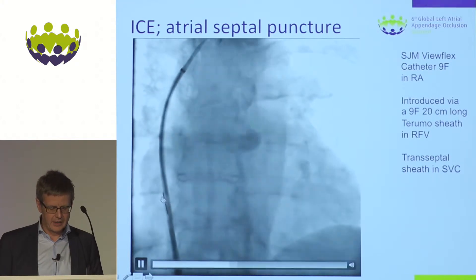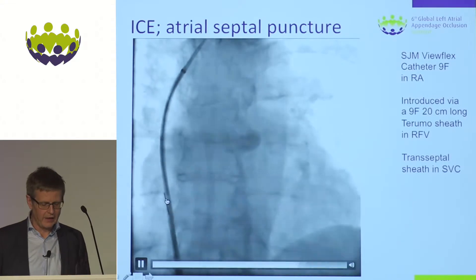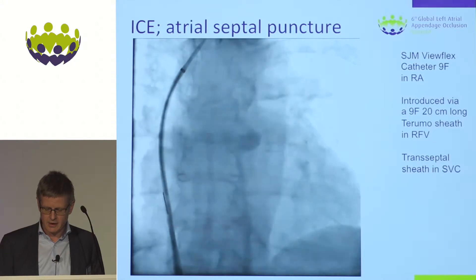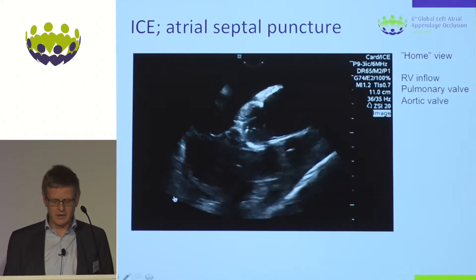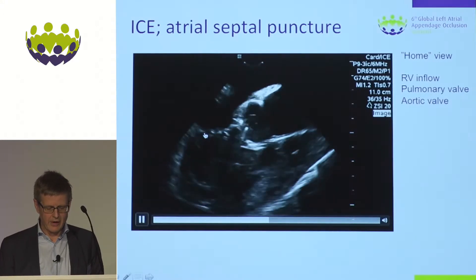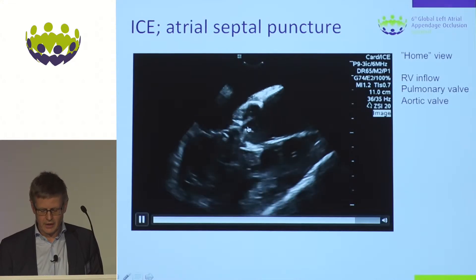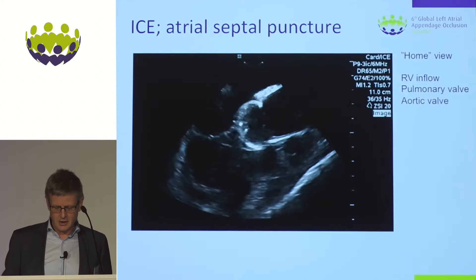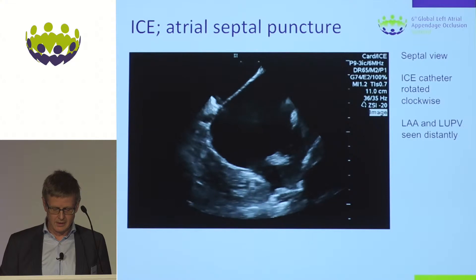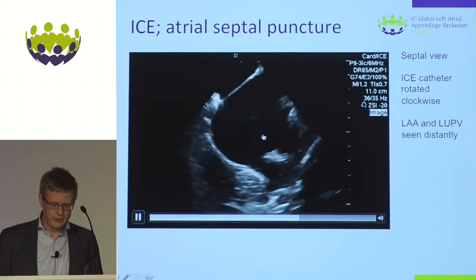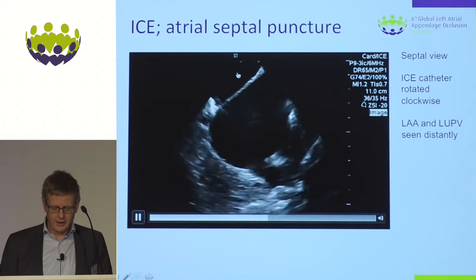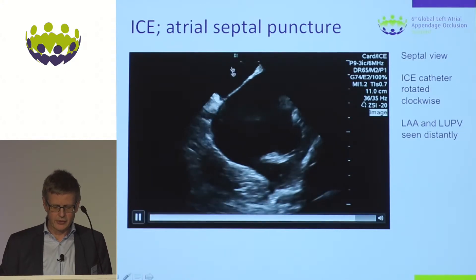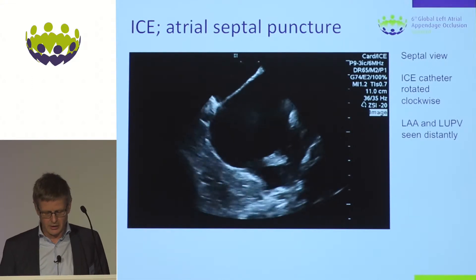The ICE catheter is advanced to the right atrium via the right femoral vein — the same vein used for the LAA device delivery, as there is no problem having a 12-French and a 9-French sheath in the same vein. In the right atrium you see the tricuspid valve, right ventricular inflow, pulmonary valve, and aortic valve. Rotating slightly clockwise gives the septal view, where you can see the inferior septum and, distantly, the left atrial appendage and a quite large left upper pulmonary vein — though the distance makes the right atrium a suboptimal window to the LAA.